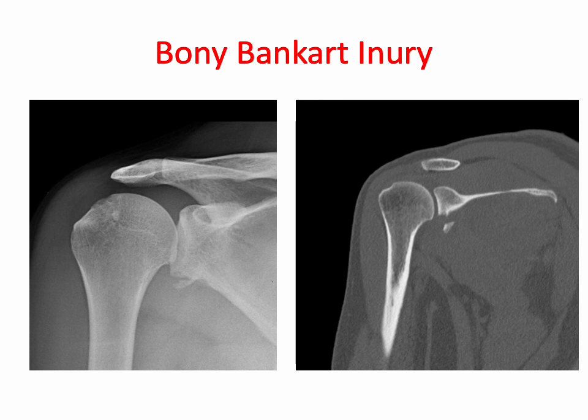And this is just a CT and X-ray of a Bony Bankart injury, where we've got a fracture of the anterior and inferior glenoid labrum. This is after relocation.